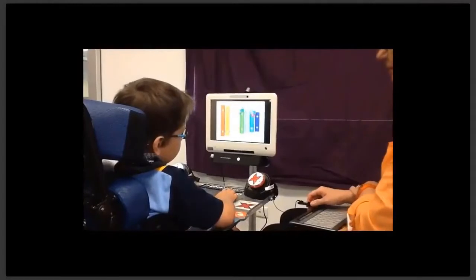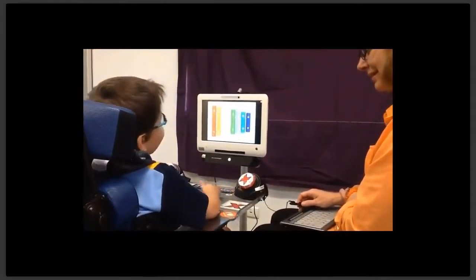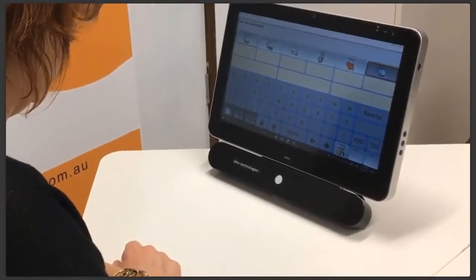The assisted mode is designed for early level or early learning eye gaze access, and it's very simple to operate mouse control. There is the AAC mode, which then includes integration with communication software such as Grid 3 and Mind Express 4. And at the top of the range there is the 360 mode, and this includes more advanced and sophisticated Windows control. Each version is upgradable from the assisted mode through to the 360 mode, so you can purchase the different levels as required.